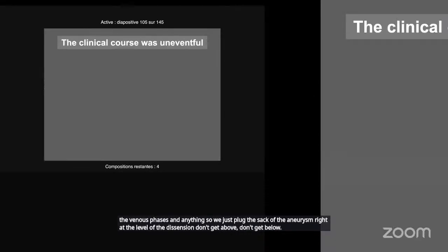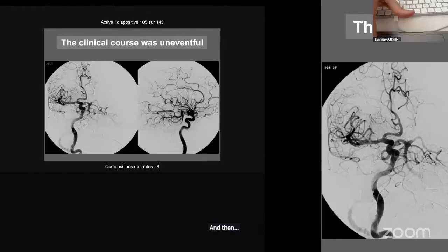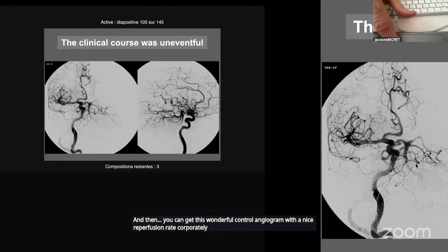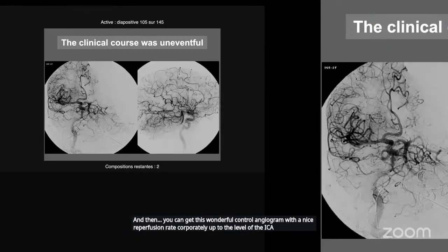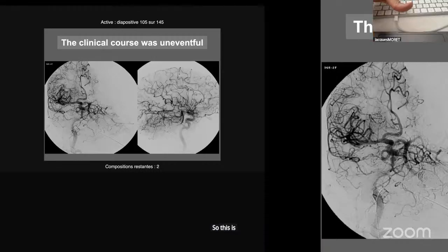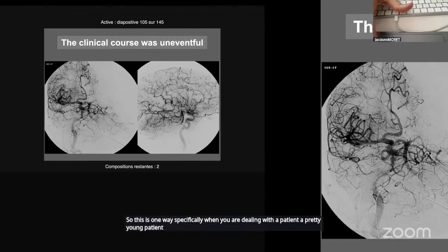And then you can get this wonderful control angiogram with a nice reperfusion retrogradely up to the level of the ICA and the occlusion of the basilar. So this is one way, specifically when you are dealing with a pretty young patient presenting with subarachnoid hemorrhage in the acute phase.